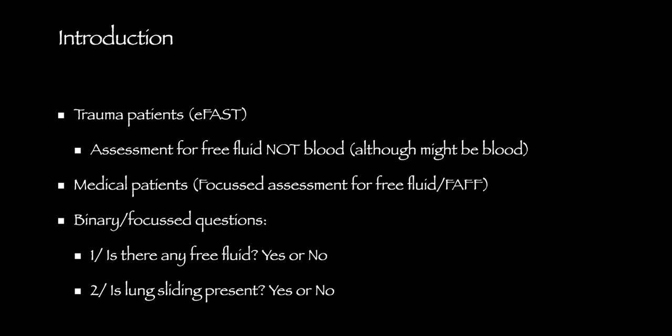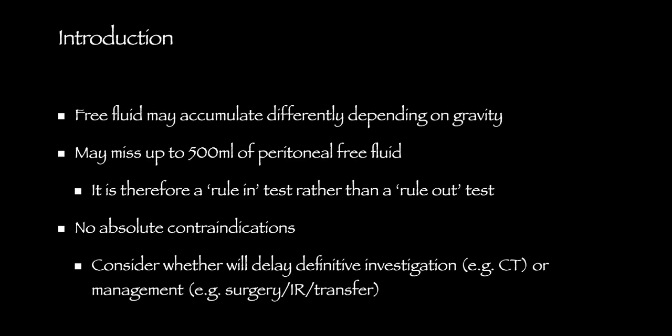With all PoCUS, we should really have a binary or focused question that we want to answer. And in this case, the questions are, is there any free fluid? Yes or no. And is lung sliding present? Yes or no. It's important to remember that free fluid may accumulate differently depending on gravity. So a patient who's walked in may have fluid in a different space to patients who have been lying on a trauma board for a prolonged period of time.